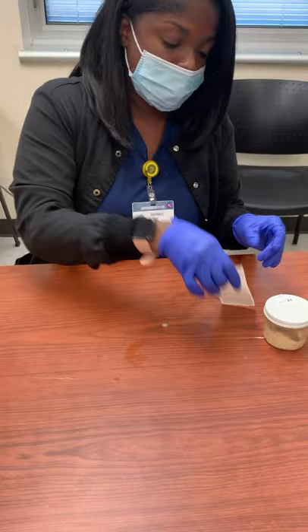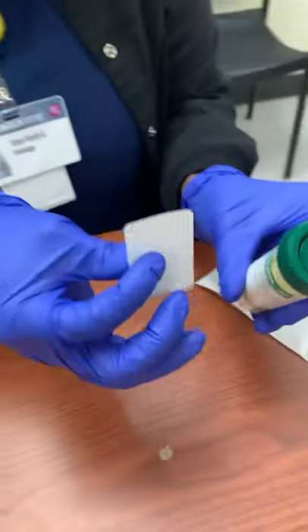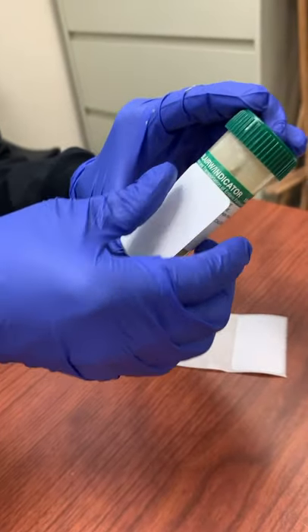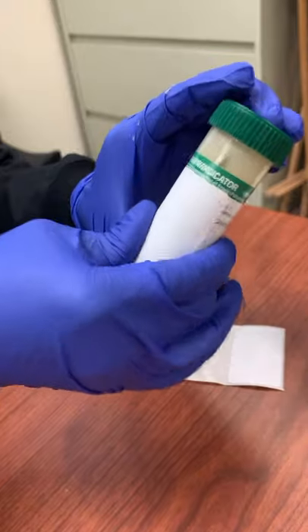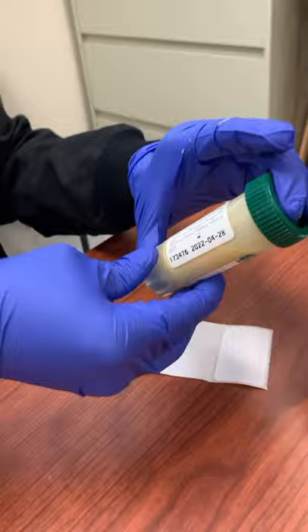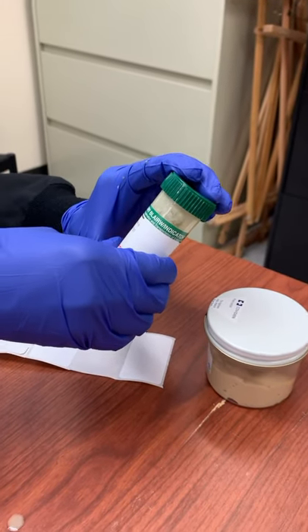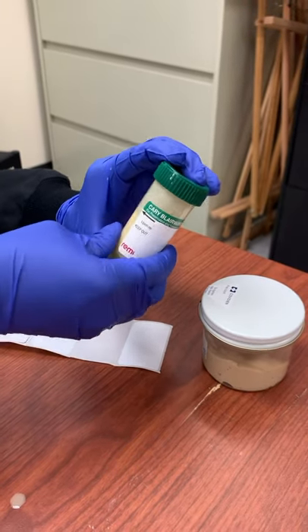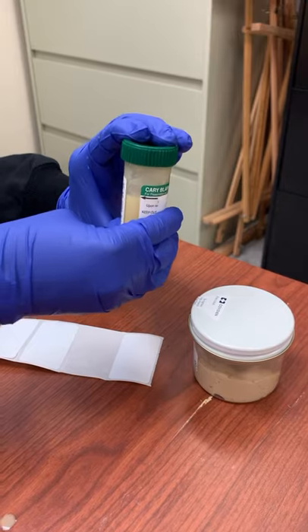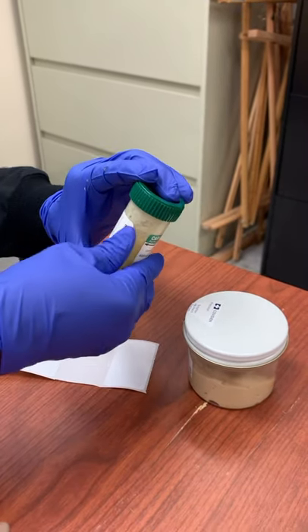You want to properly label the container. Make sure the Carey Blair is not expired. When you place the label on the Carey Blair, make sure it is not covering the line and that there is clearance there, because we want to see the measurement. And again, make sure the Carey Blair is not expired.